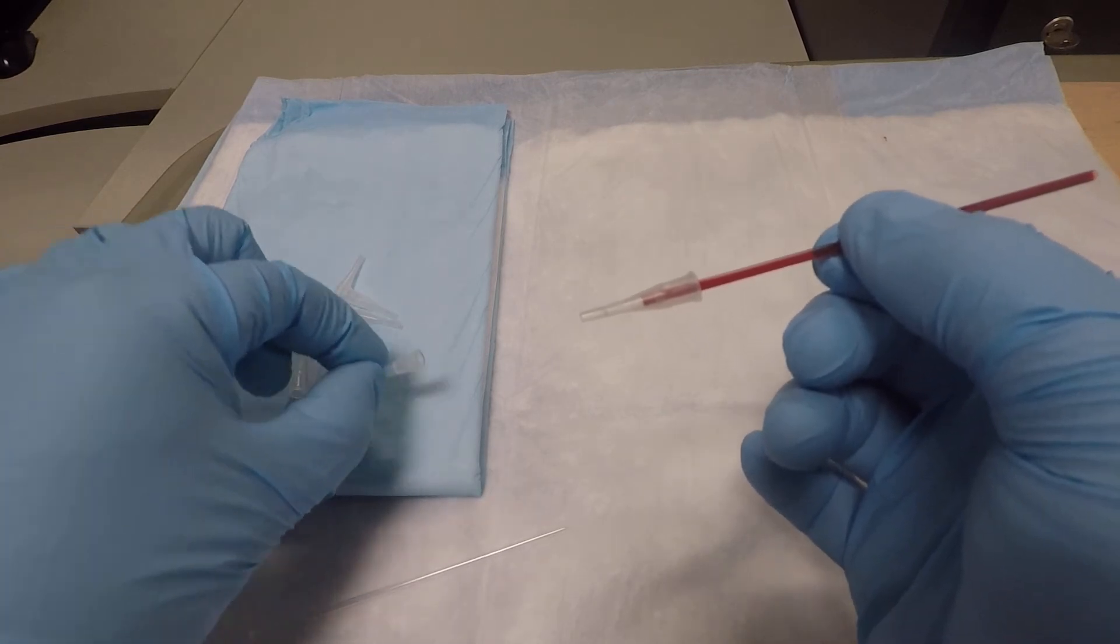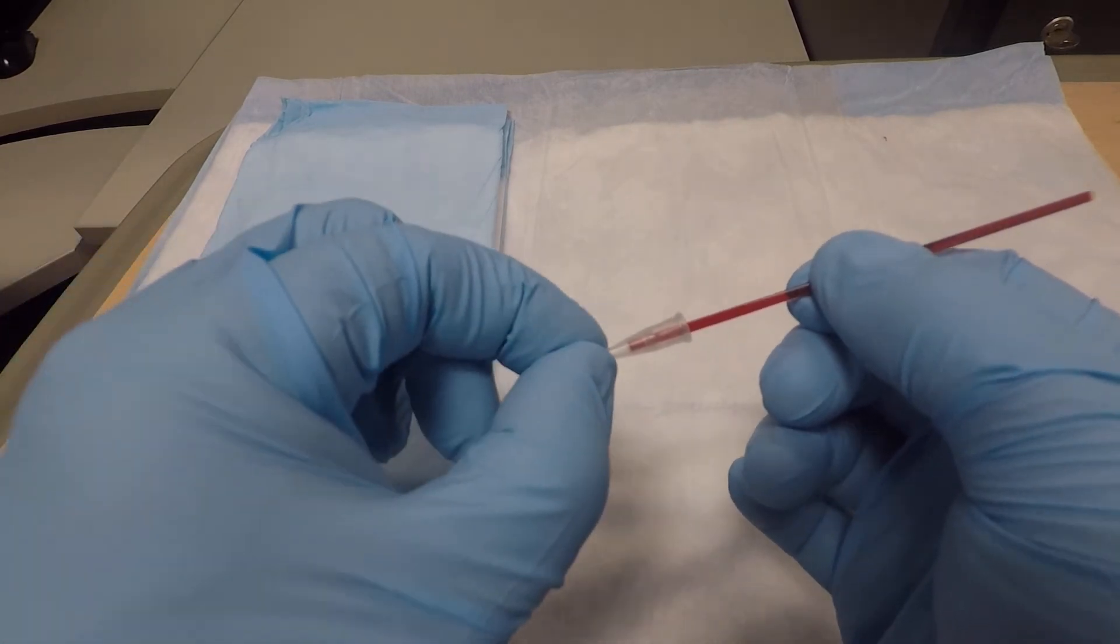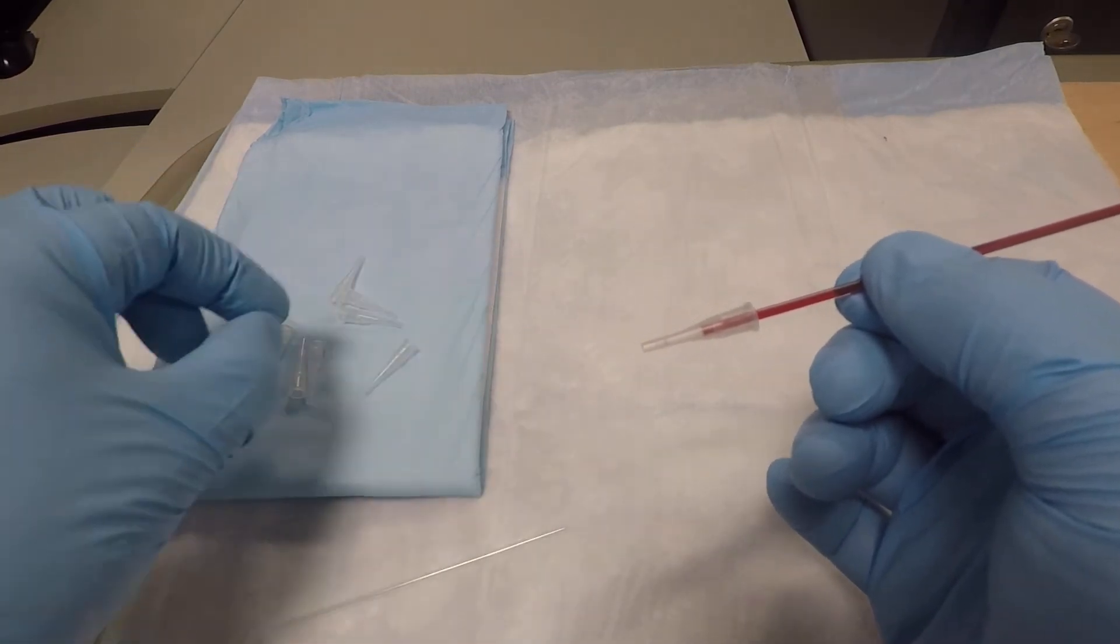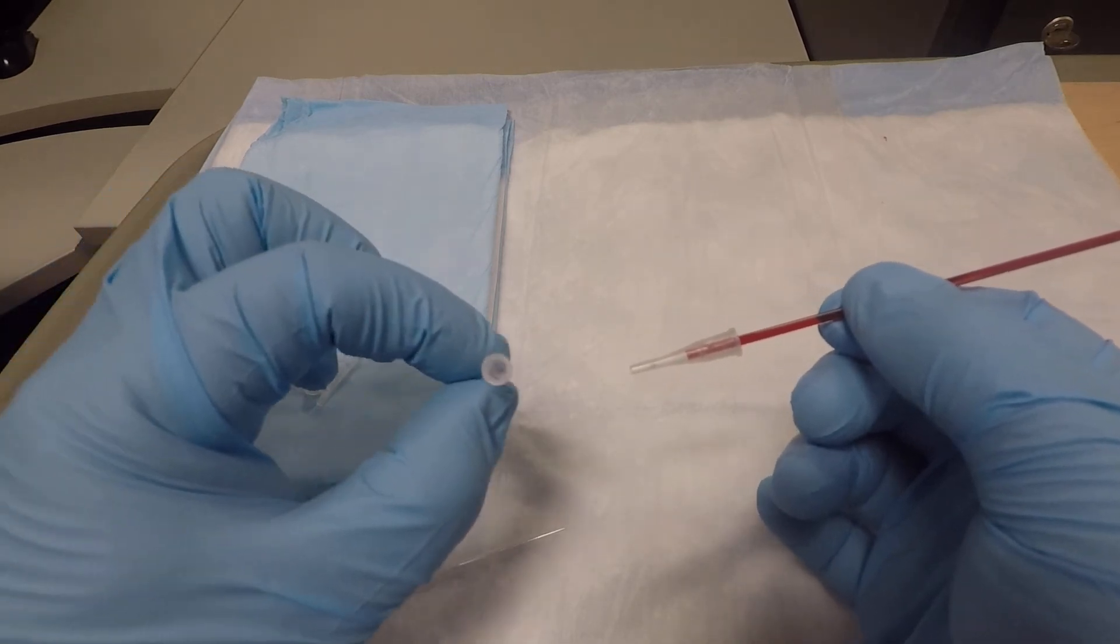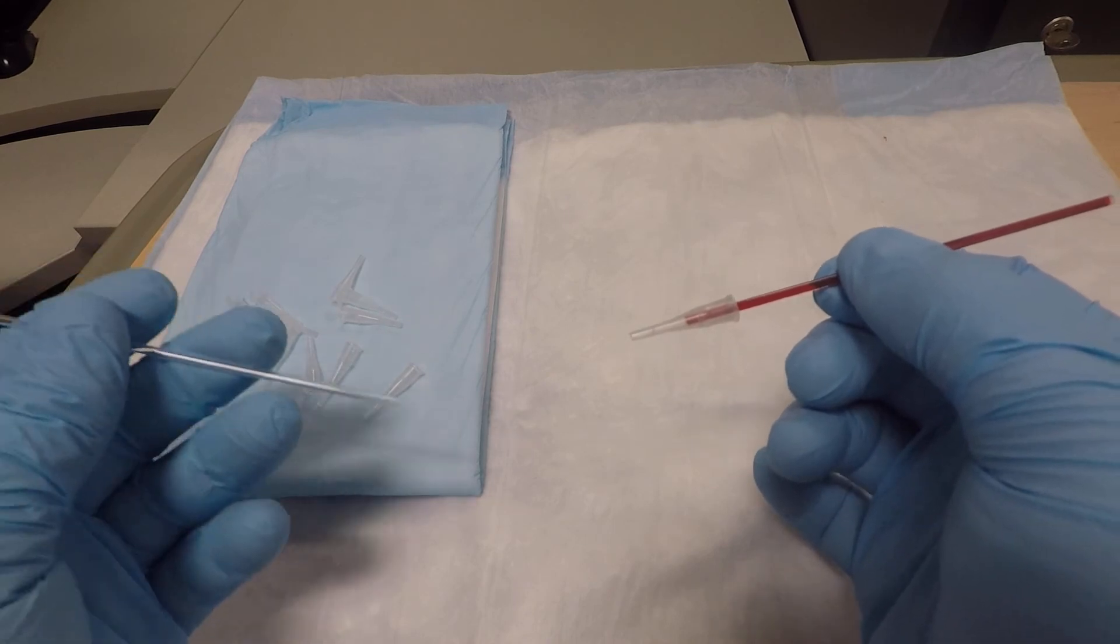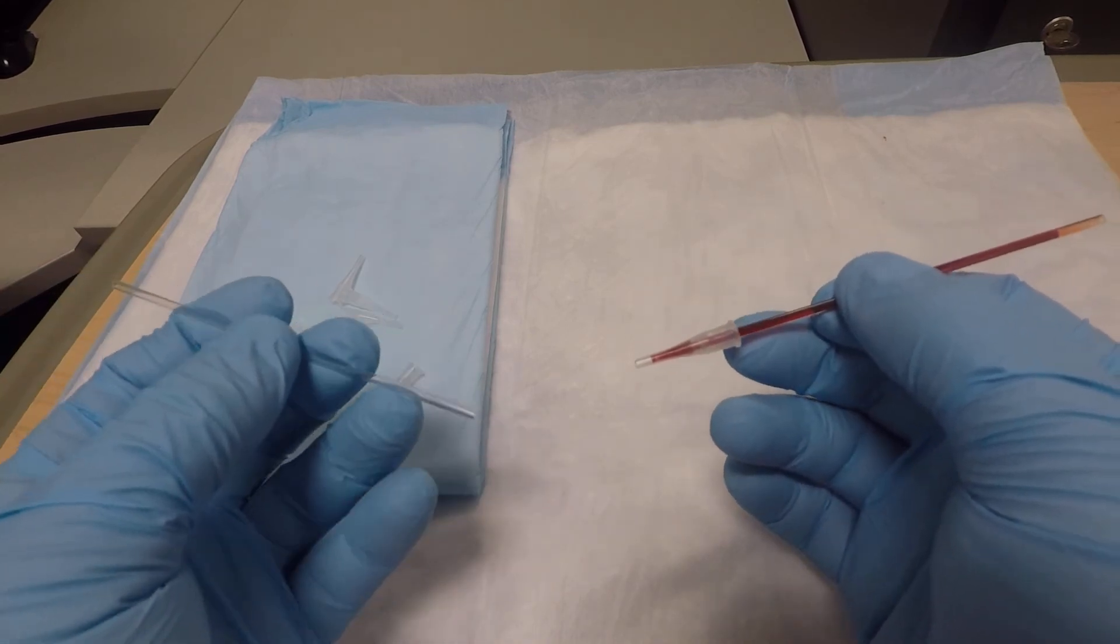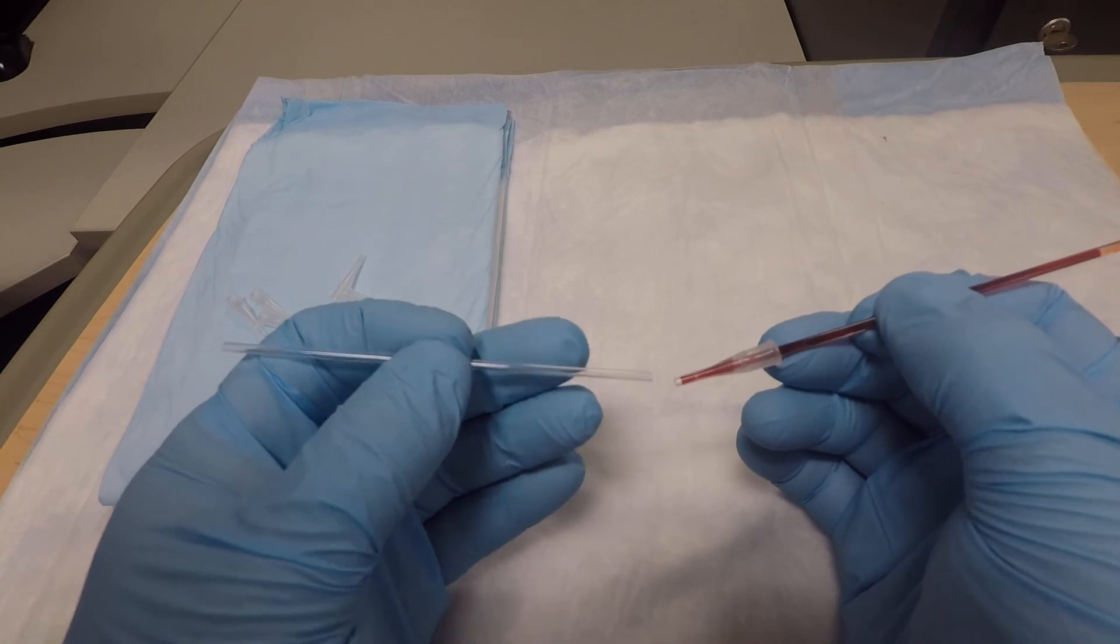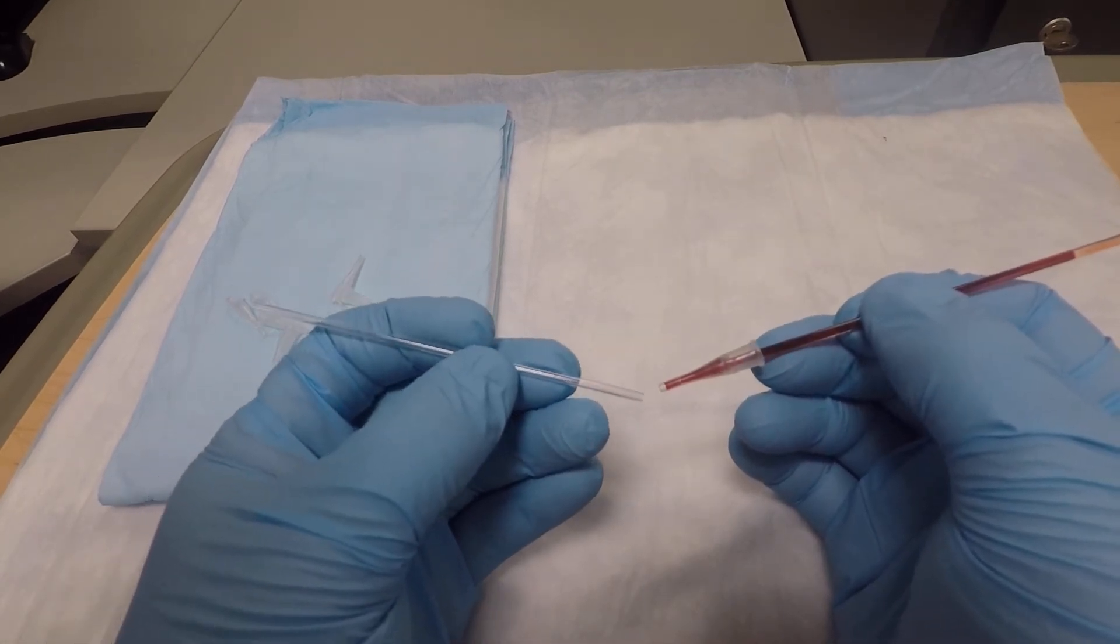First, take your clot catcher and slide it over. As you can see, it fits very well and has a little filter in the bottom. Then you'll transfer it down and you'll see it go down. Now the hard part: transferring it.